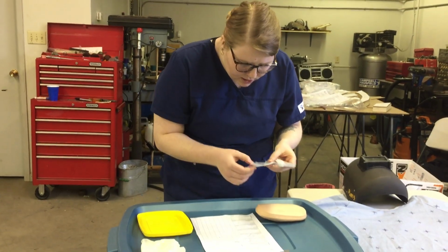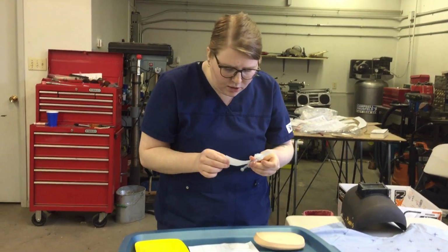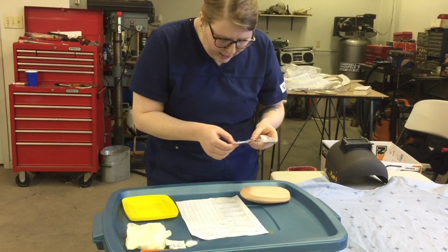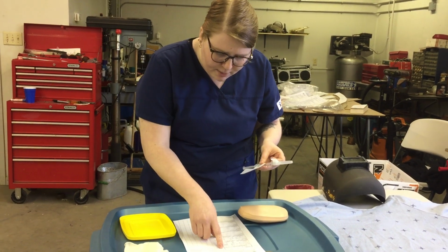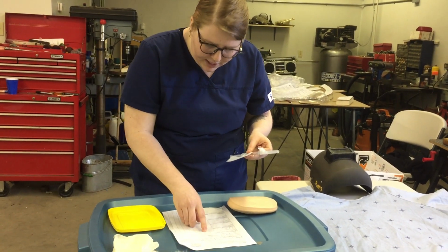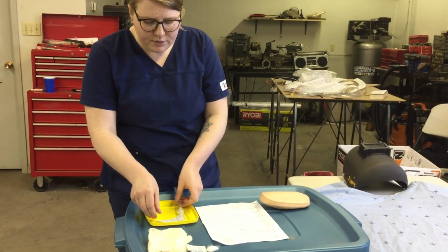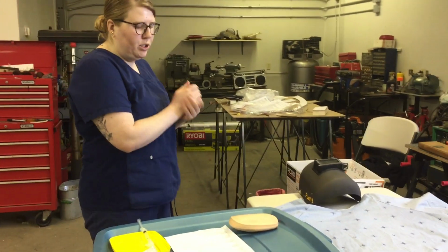We have intramuscular, this is the correct intramuscular needle. It's to be given daily at 2100, and I have 2030 on here, which is the correct time. It's the 7th at 2030, so we're within the time frame, so I can go ahead and administer this drug now. After I've done that, I'm just going to go to my patient and explain to them the procedure.